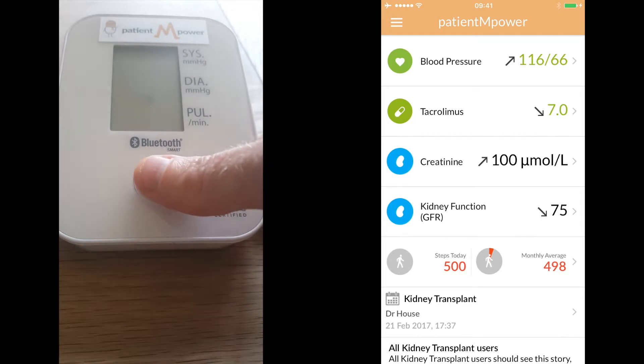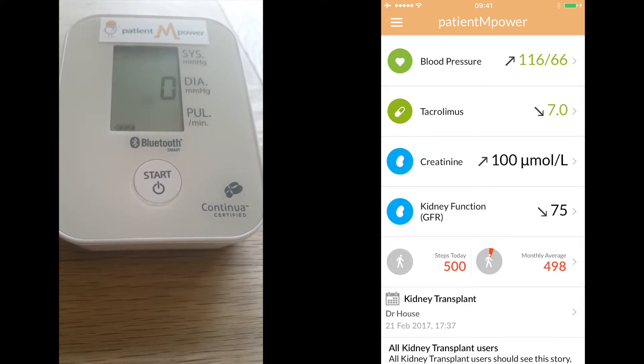Press the start button to begin the test. You should feel the cuff inflate.